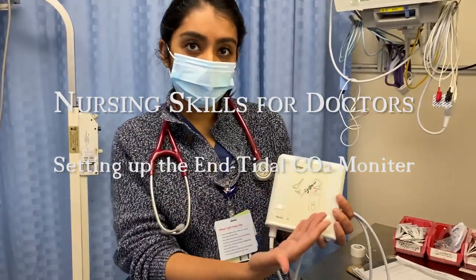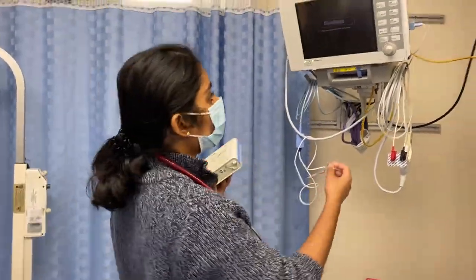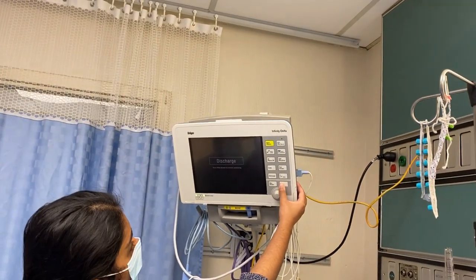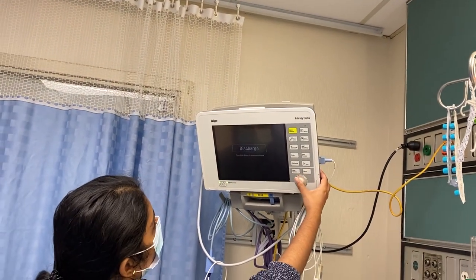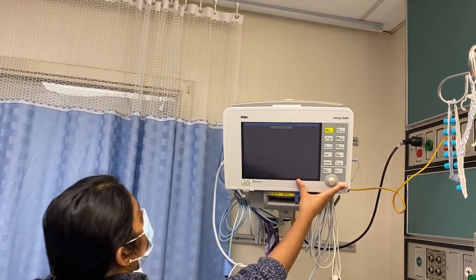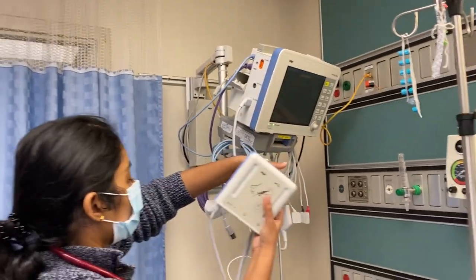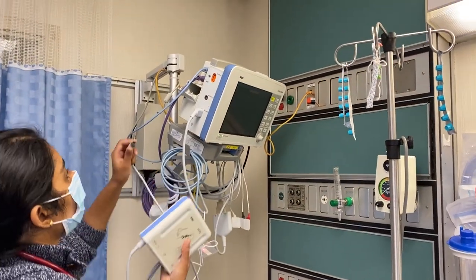Setting up the end tidal CO2 this morning. So first thing you want to do is turn on your monitor and that main screen. There we go. So your monitor is on, and then you want to plug your end tidal CO2 into the side of the monitor.